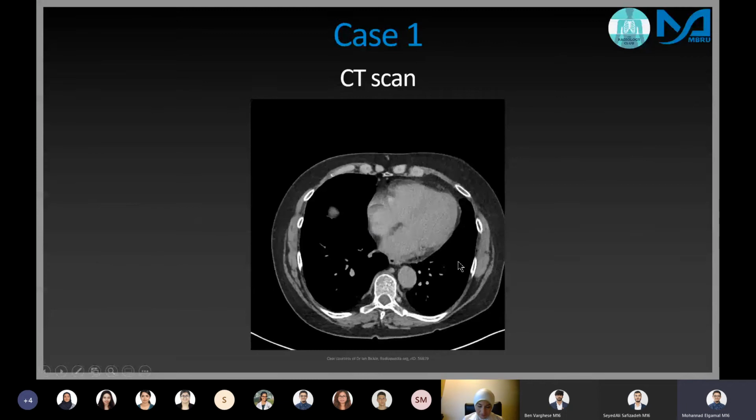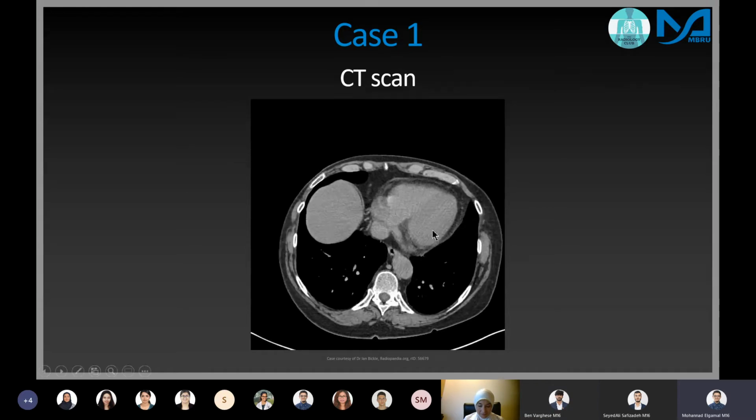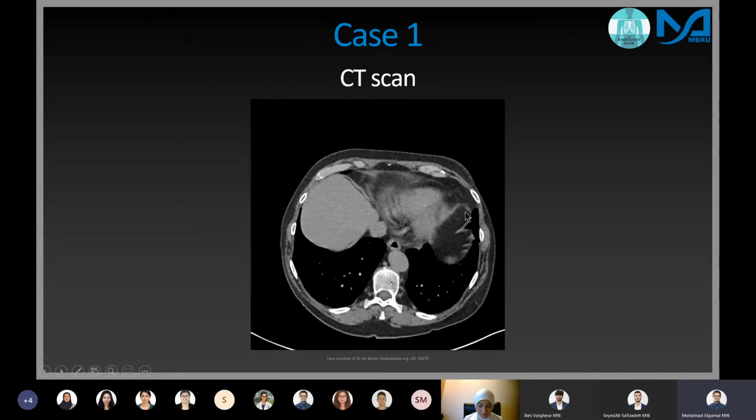Usually when you do a CT, so can anyone tell me what this is, what plane and what window? I'll keep it around here. This is soft tissue. This is between soft tissue and bone. You're right, but you can see the bone is a lot clearer, but you can still kind of distinguish between the soft tissue. A soft tissue window would be sort of brighter, I guess.